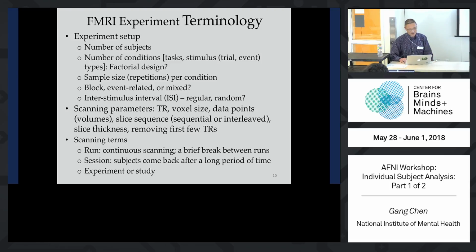So there are a bunch of other terminology I'm going to skip. But lastly, I want to say there are the concepts of runs and sessions. Across different runs, that means usually you scan the subjects, but they usually cannot stay in the scanner for, like, for example, 1 hour. Right? That's just too much.